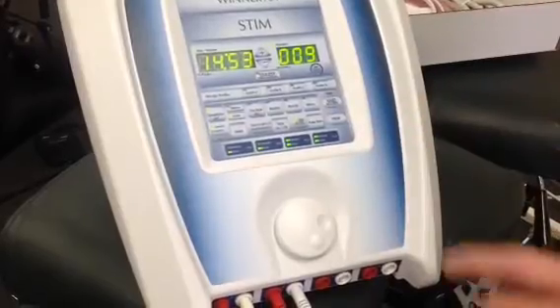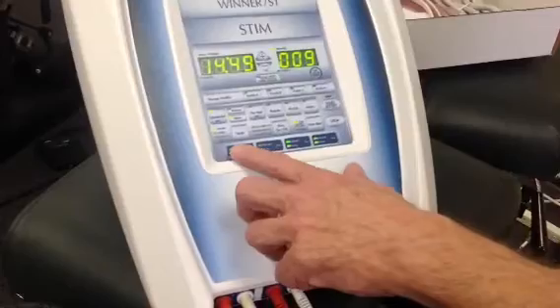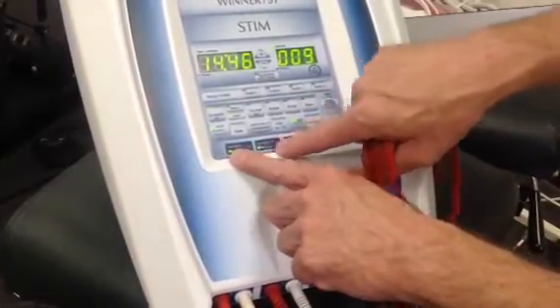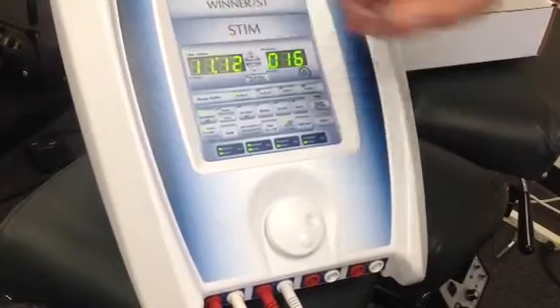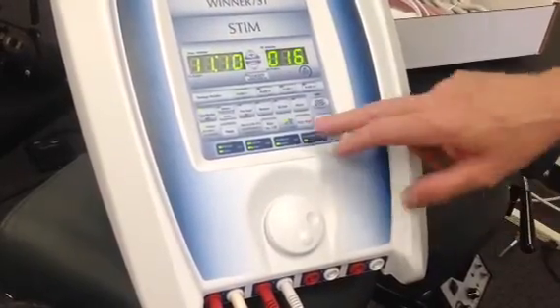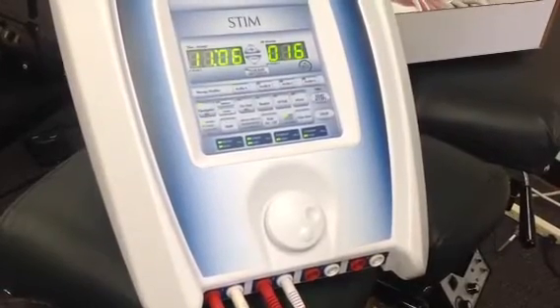And if you say, okay, so what's the time right now? We have 14:51 left on patient B. Patient A, as soon as I push one of these 2 buttons, the timer changes to what's left there. And that was 11 minutes, 12 seconds. So you just toggle back and forth by whichever button you push.